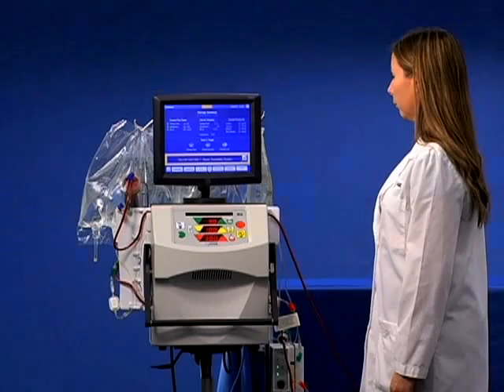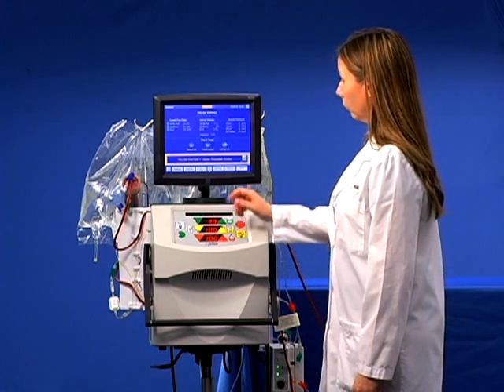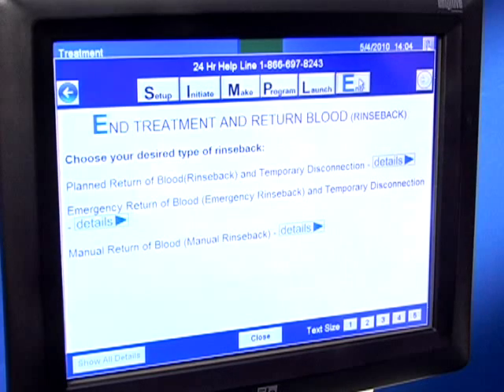To end the treatment and return the blood, click on the end button in One View. Choose your desired type of rinse back by referring to the end treatment module. Congratulations, you have completed the Next Stage review of the simple module.